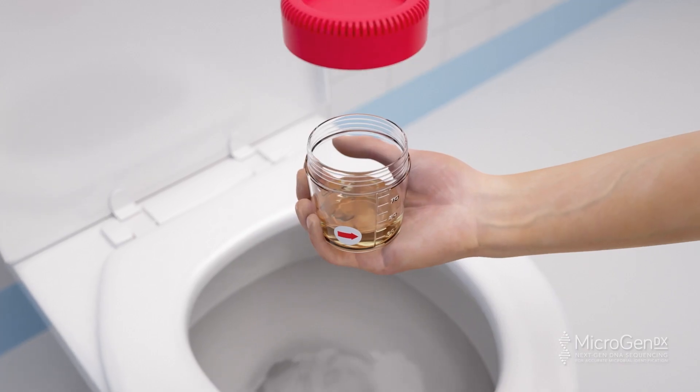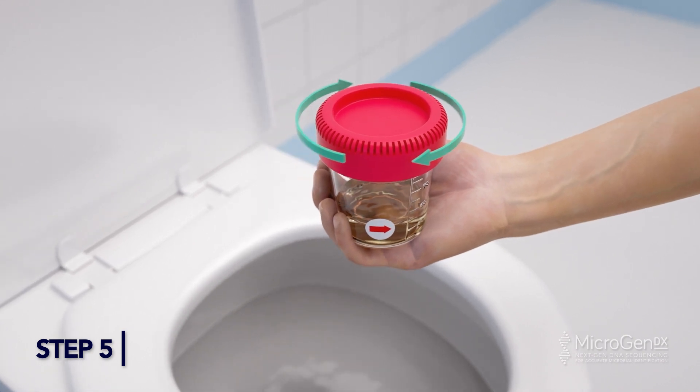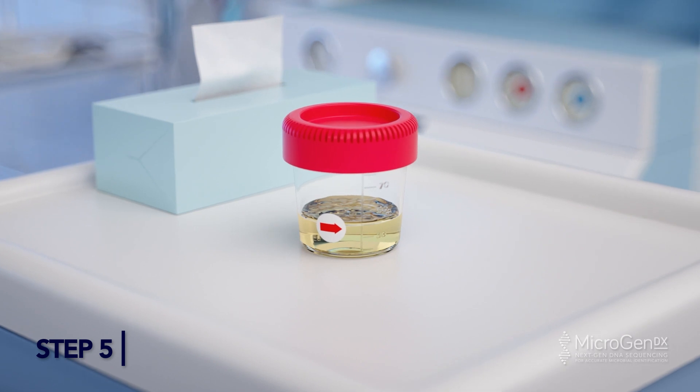Step 5. Finish urinating into the toilet. Secure the lid tightly by placing the lid directly on the cup and turning until you hear two clicks. This indicates the cup is locked.